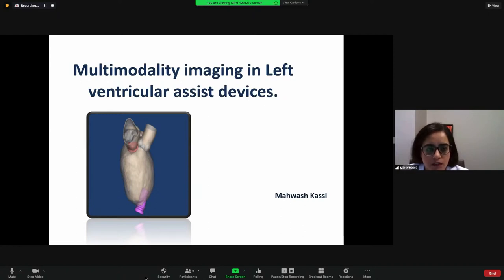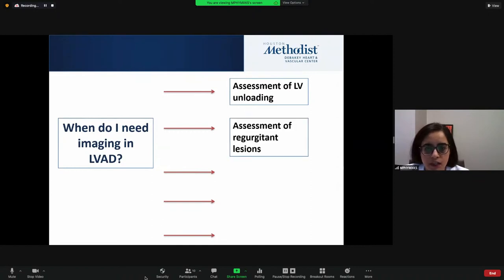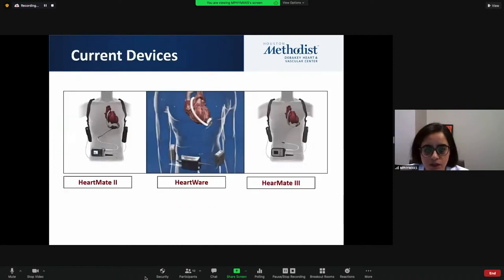In the first 30 minutes of this presentation, I will talk about echocardiography, a heart failure specialist's view of it, and what I want when a patient undergoes an echocardiogram. When I order an echocardiogram, I need assessment of LV unloading, assessment of regurgitant lesions, and a look for thrombi, RV dysfunction and RV failure, which is basically the bane of our existence when following patients with LVAD. And then, of course, troubleshooting alarms, including low flow and suction.